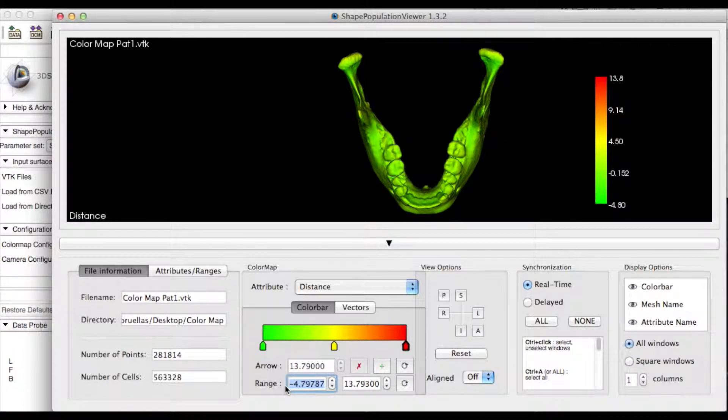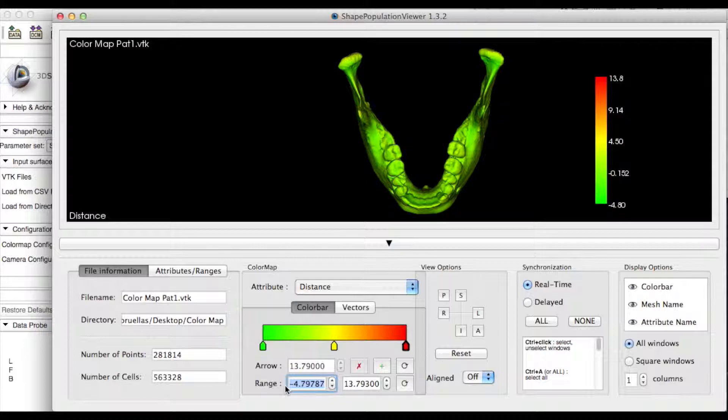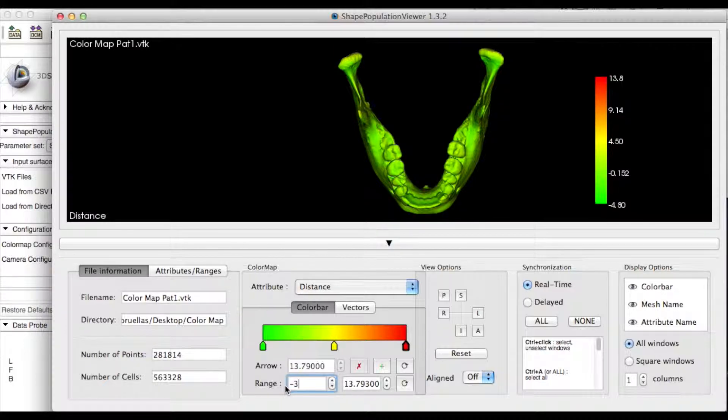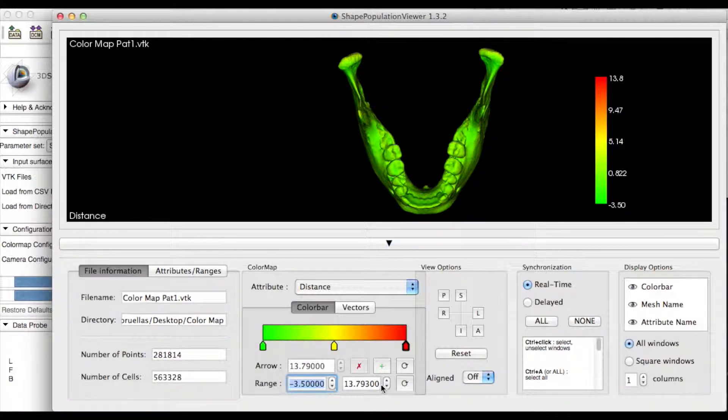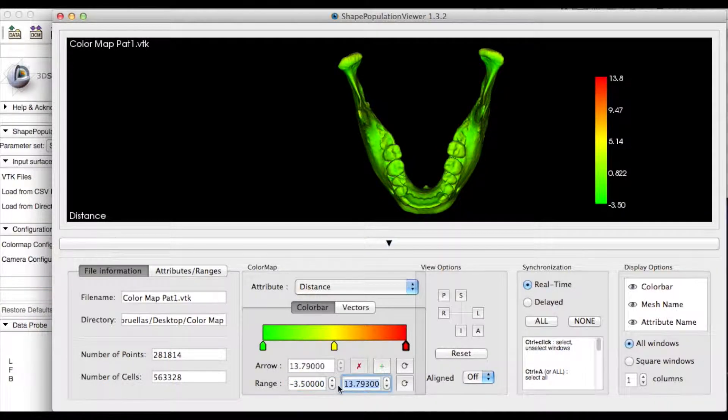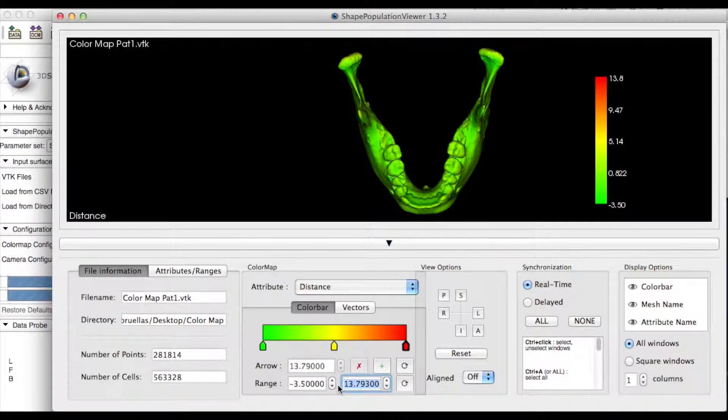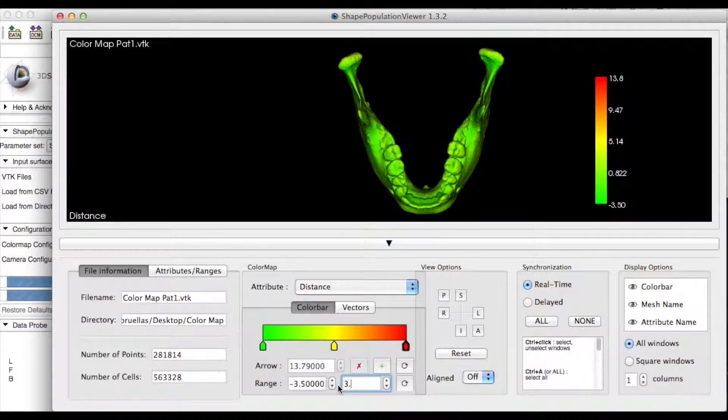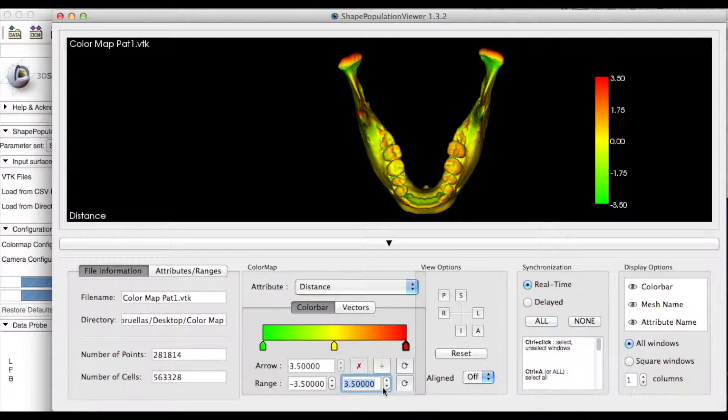You can change the range to determine the difference you want each color to represent. Here, we use negative and positive 3.5 millimeters. The range can be adjusted until you see small areas in red.